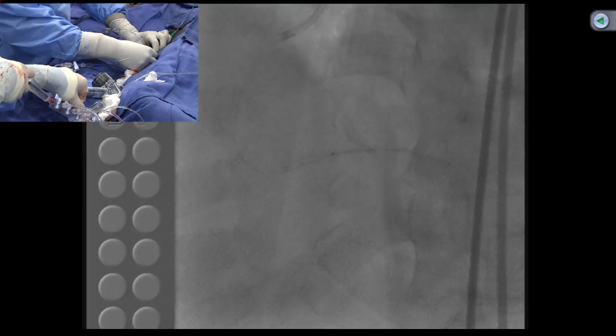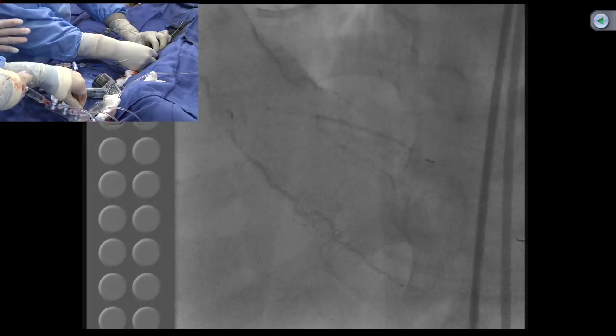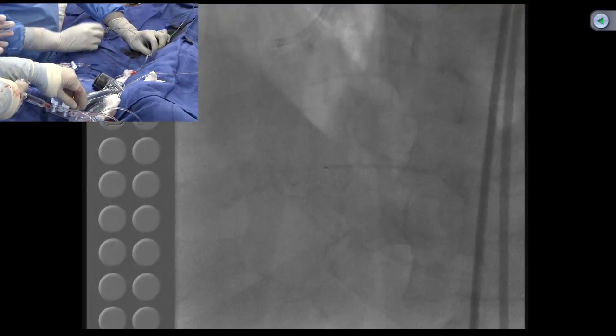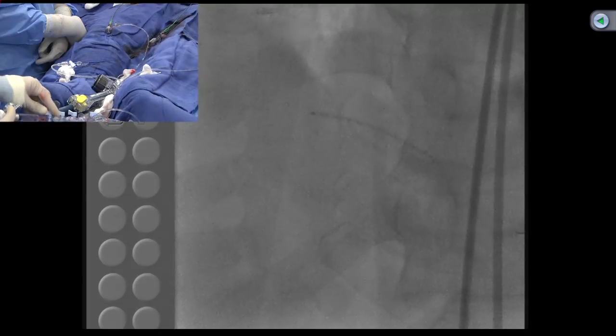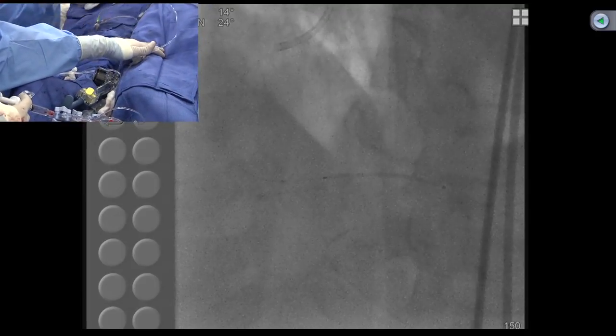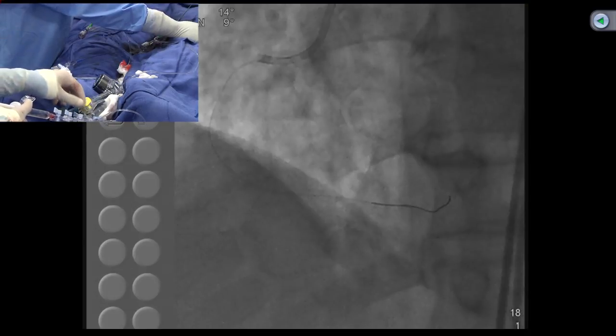Going. Some dye. It's bad. Yeah, now it's okay. I would take a 3.8 then. Okay. My preference is, why not you just put after the bifurcation. Leave the bifurcation alone for the time being, and we put one into the distal. Take a picture. Yeah, here.